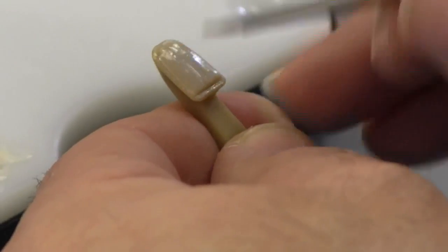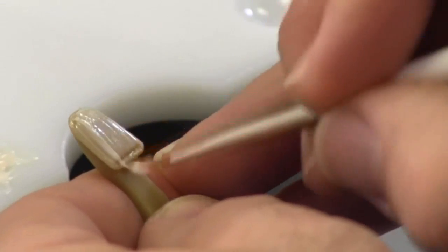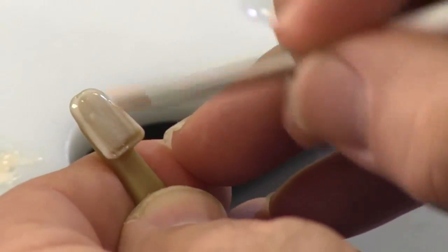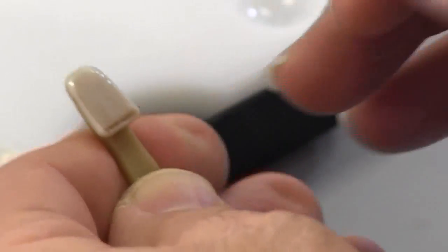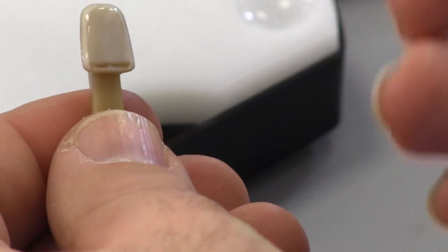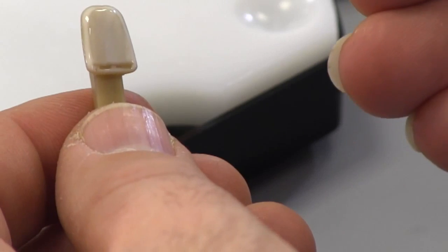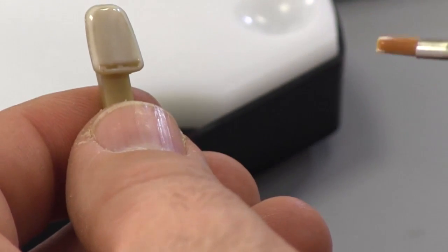Then I add another coat to that surface just to try and neutralize that color. If you notice, when I use this, I'm not over-opaquing with the Pink Opaque. I'm just using it to neutralize and keep that value, the gray value down, but keep the value of the tooth up when I put the next material over the top.